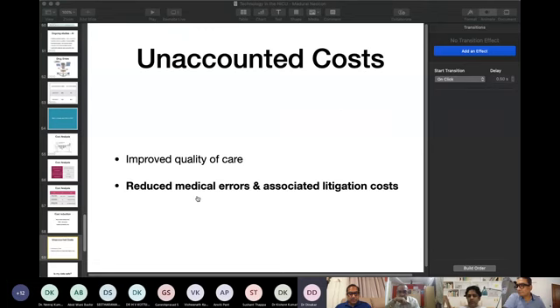Suresh and Ram, you might have gone to the exhibition. There you might have seen only around 90 to 120 gram syringe pumps, and around 225 grams for the infusion pump, costing around 70 to 75 thousand Indian rupees. What we use at present, any company in India, is 1.8 to 2 kilos. That's the minimum syringe pump weight, and the bulkiness.